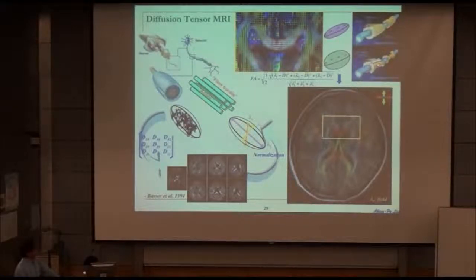Then we can see the diffusion along this direction increases, so the ellipsoid model also changes. To know the difference between the two shapes, there is a very easy measure: the standard deviation of the 3 diffusion coefficients. This standard deviation is the fluctuation, or anisotropy, a major quantitative index.